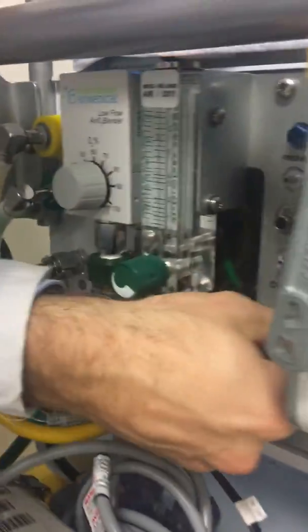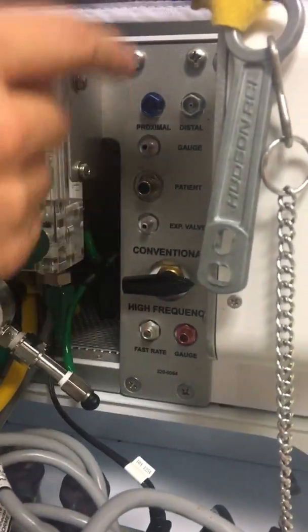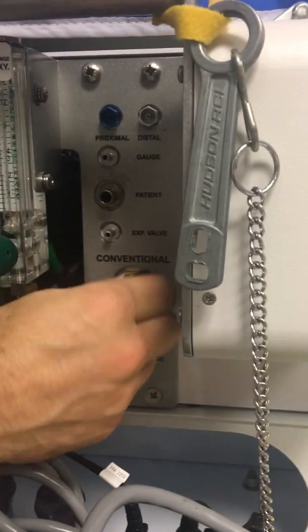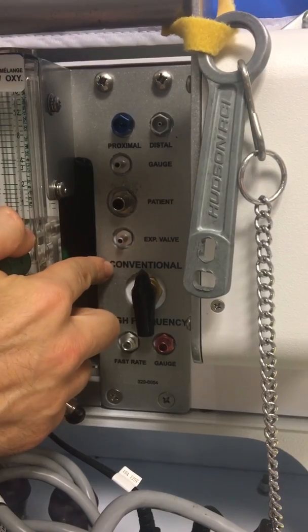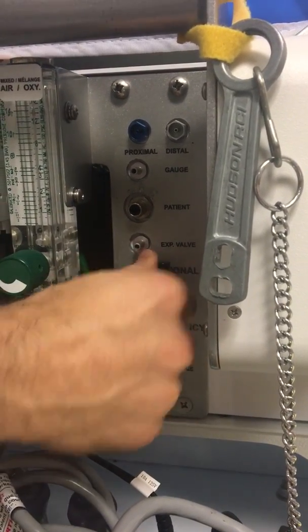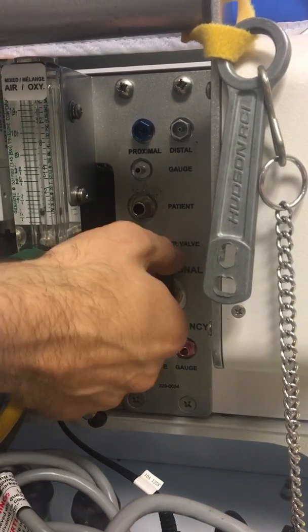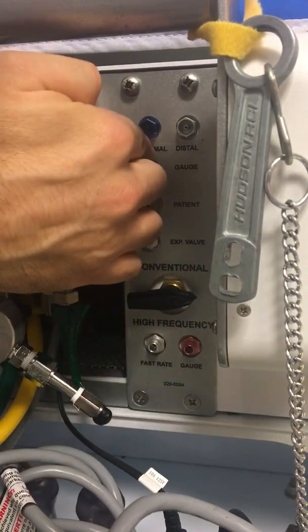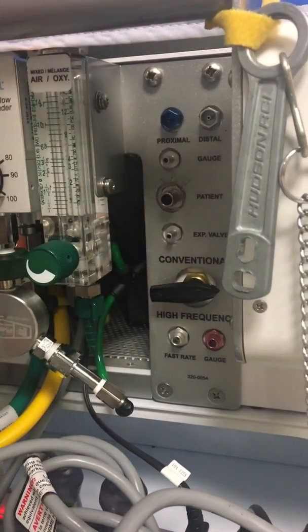Over here we have a knob that's in the middle — it's bringing air to neither conventional nor high-frequency. If it's pointed up, the gas source is going to conventional. If it's pointed down, you'll hear some noise and the gas source is going to the high-frequency. These are the high-frequency outlets, and these are the conventional outlets. We'll discuss that in another video.